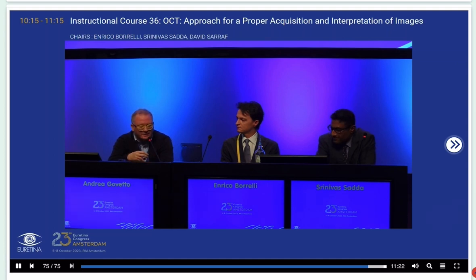And this can slow down your clinic. So it's a matter of finding a balance between the flow of your clinic and what data you want to use from your patient. It's not easy. It's very hard actually to find the balance. But it's important to have an imaging protocol. Very, very important.